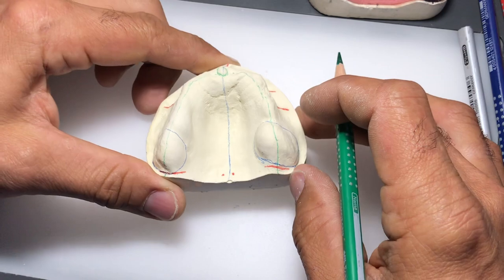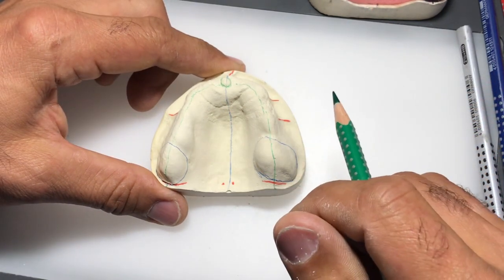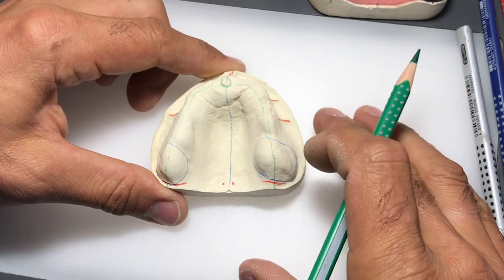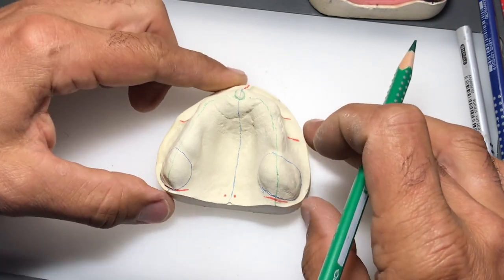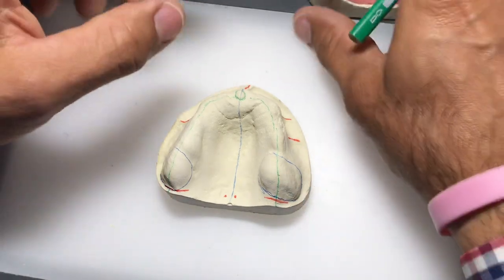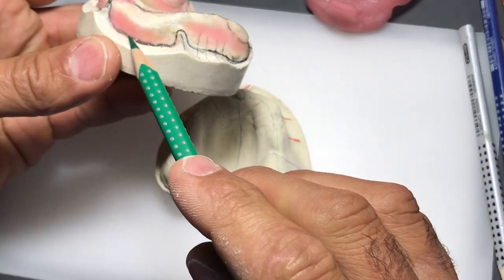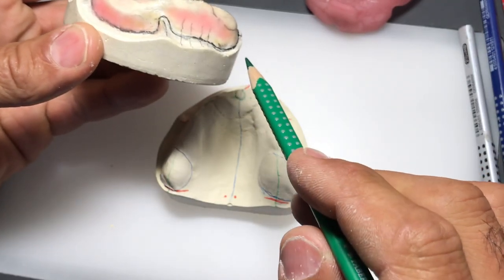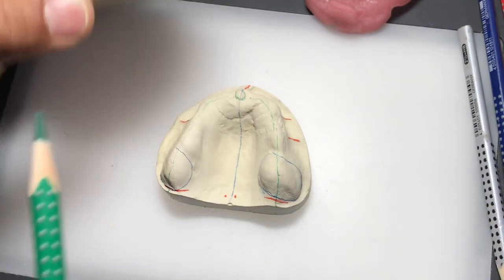There are many more landmarks we could identify on this model - like the rugae - but we don't need those right now. We just need enough information so we can start outlining this line to determine the extension of the custom tray.